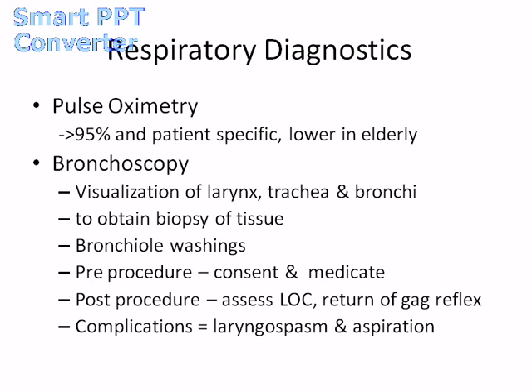They can also do it on somebody who's on a ventilator. So if somebody has been intubated and has an endotracheal tube in, they can do the bronch right through that endotracheal tube. So they're looking for abnormalities, tumors, inflammation, strictures. They can also get biopsies. If they suspect lung cancer, they can take a little bit of tissue.